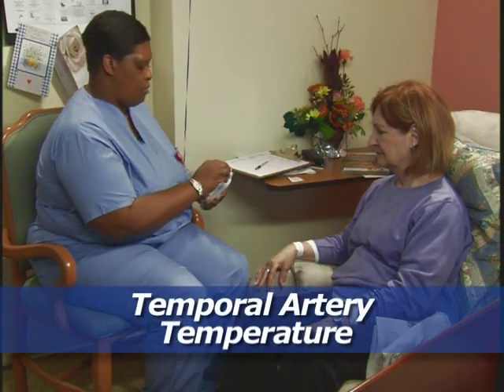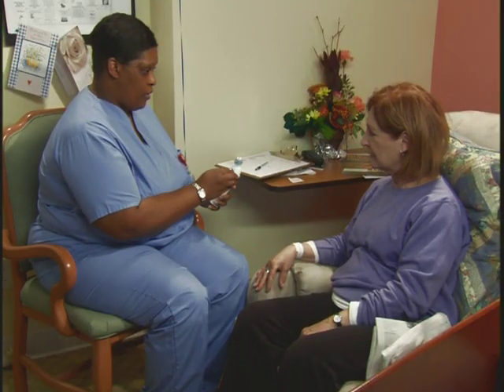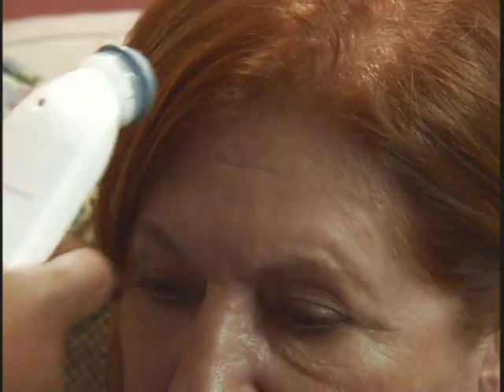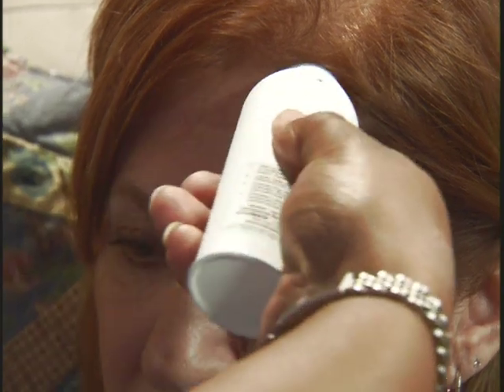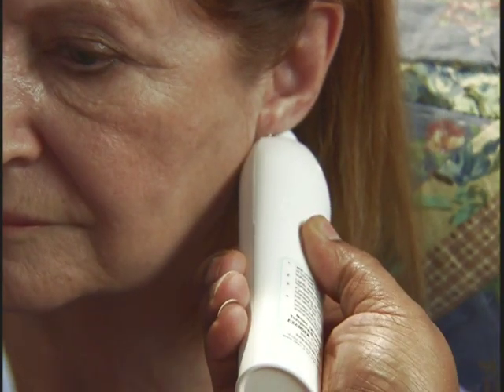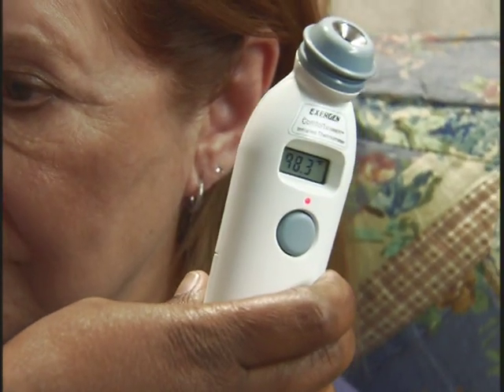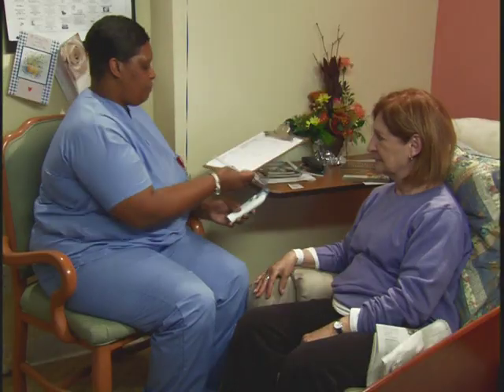For a temporal artery temperature, follow the manufacturer's instructions and either place a disposable cover on the probe or clean it with disinfectant. Place the probe in the center of the patient's forehead, press the button, and hold it down. Slide the probe across her forehead and into her hairline, keeping it in contact with her skin. Then place the probe on the neck behind the ear. Release the button and read the temperature on the thermometer. Tell the patient her temperature. Record the patient's current temperature, comparing it with her baseline measurement and with the acceptable range for her age. Clean the thermometer with disinfectant or remove the disposable cover if used.